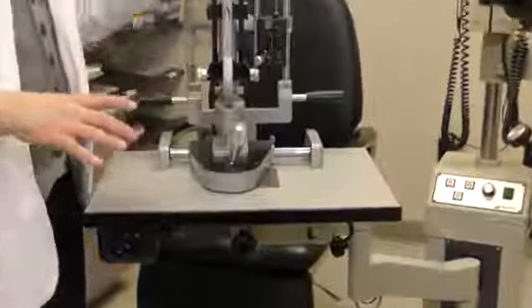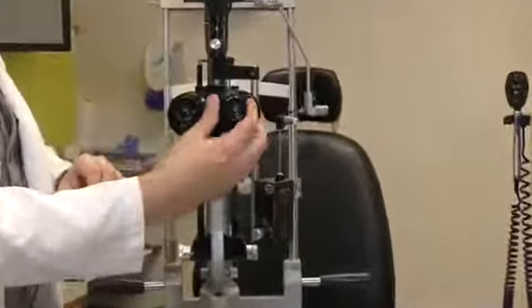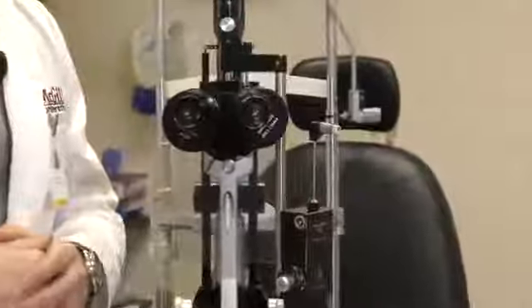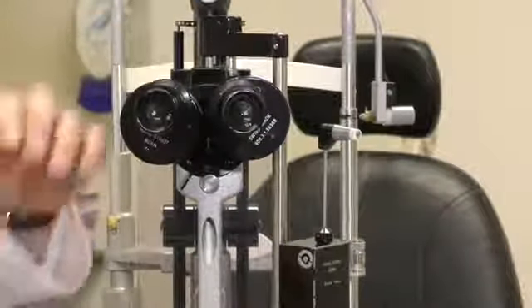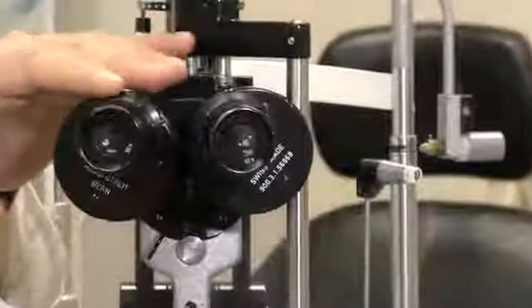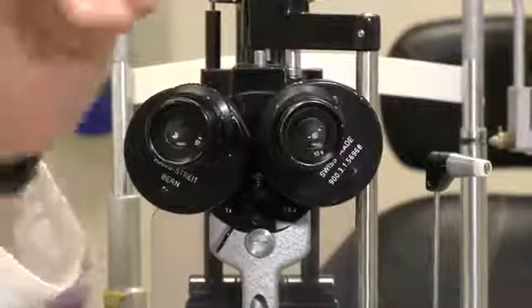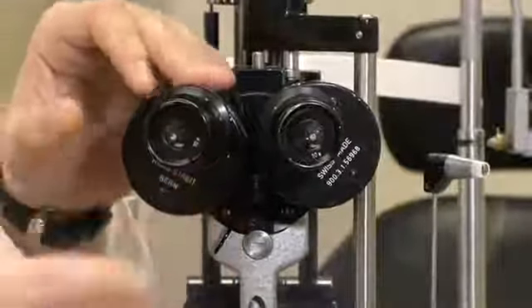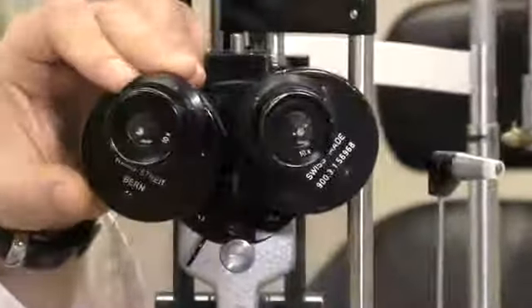Next, I'm going to bring your attention to the binoculars here. This is also very important to set up before you examine the patient so that you can have a good view of the different structures of the eye. Usually it's set on 0 with no prescription dialed in. That's because most people use their glasses or contact lens correction when using the slit lamp. But you can also take off your glasses and dial in your prescription if you don't want to use your glasses with the slit lamp.